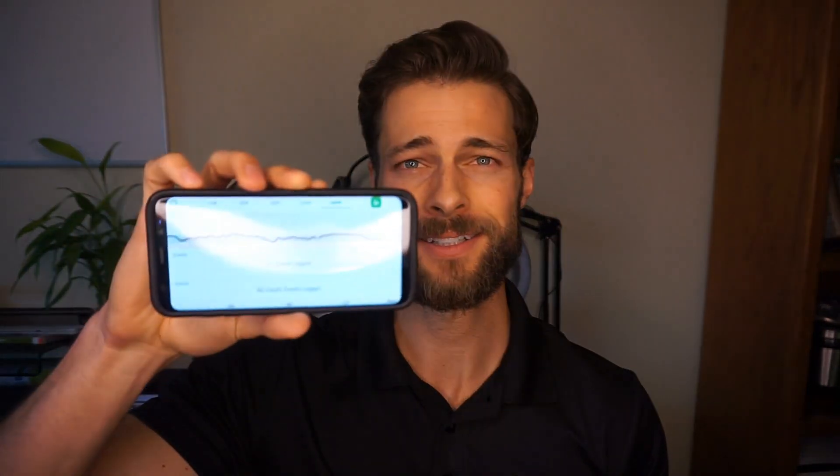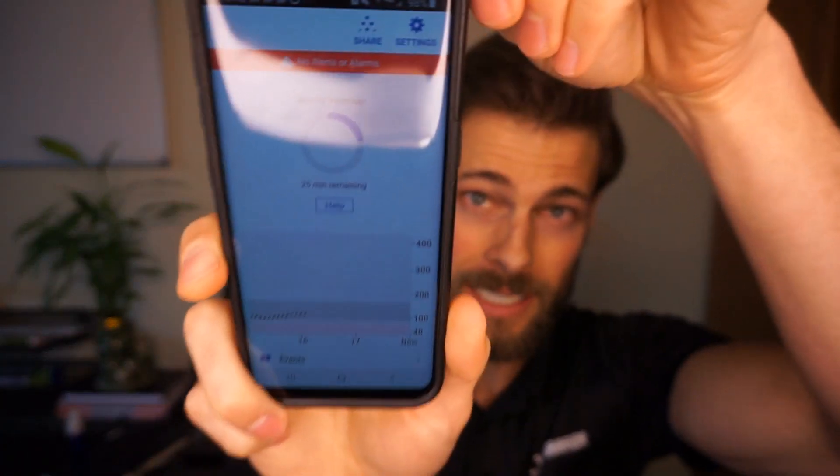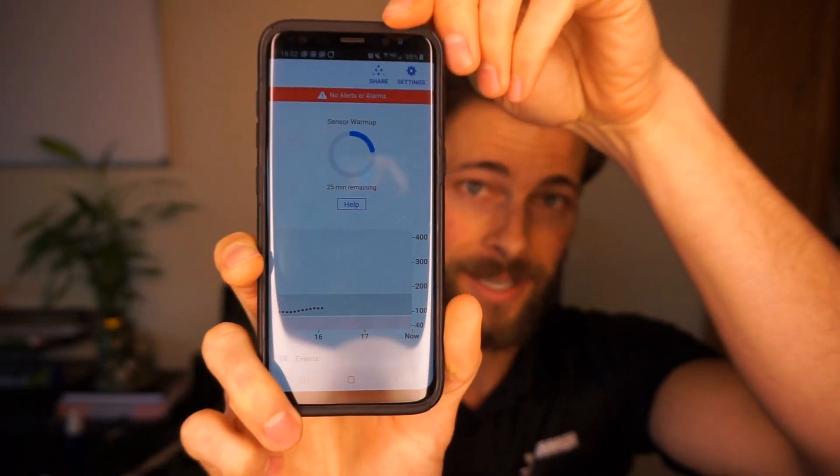Alright guys, so I wanted to give you an update. Got the Dexcom — it is still secure in there and we've got about 24 hours range again. I'm going to flip this around so you guys can see we have officially 25 minutes remaining. I think it's gonna do it. It's looking good. Usually it freaks out and beeps at you within the first 15 or 30 minutes if it thinks you're restarting, so I think we might be in the clear here guys.